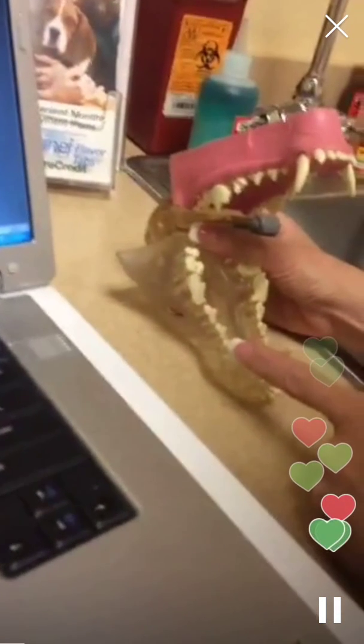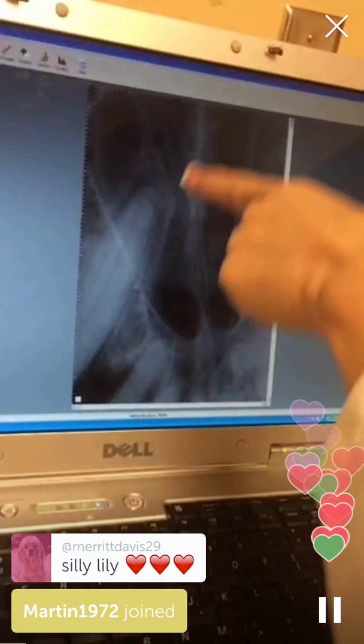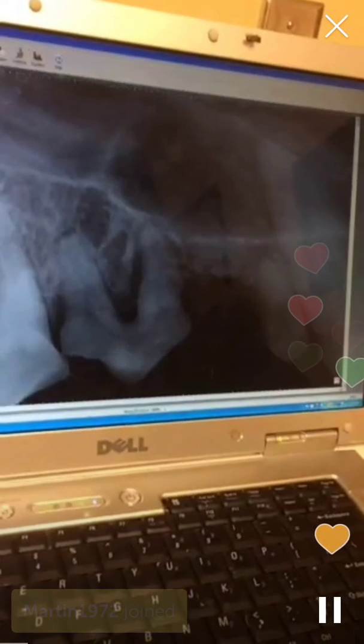So we're now going to be on this side here. Canine tooth, upper right side with the dog laying on its back. And so this is the canine. The root looks fantastic. This is one of the bigger roots that goes up into the sinuses. So if this abscesses, it can sometimes go up and cause a sinus infection. But that tooth looks fantastic.